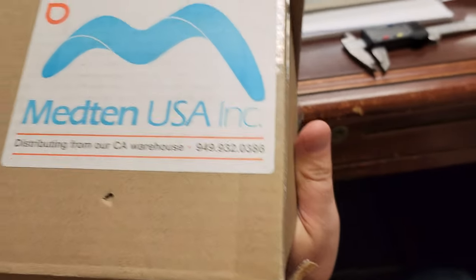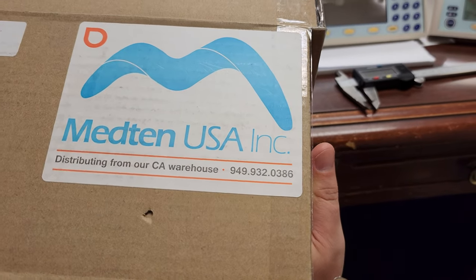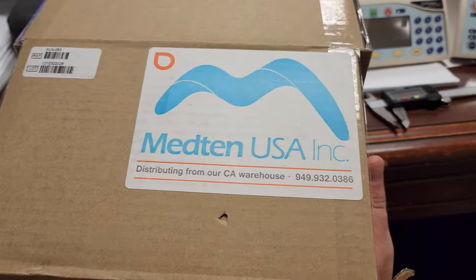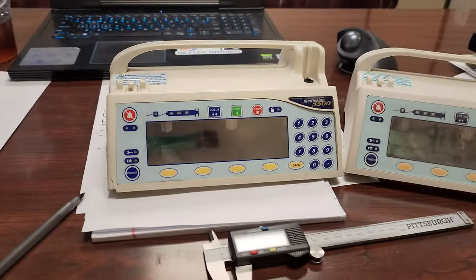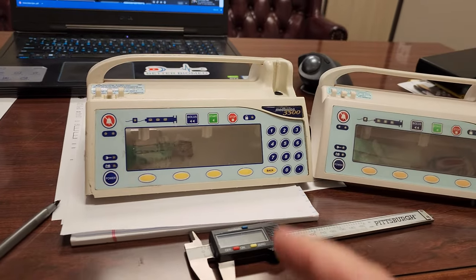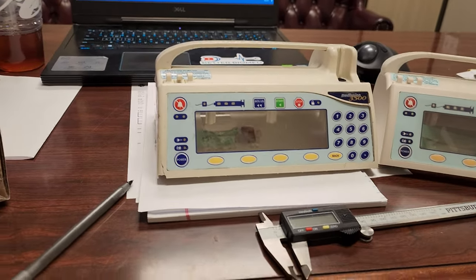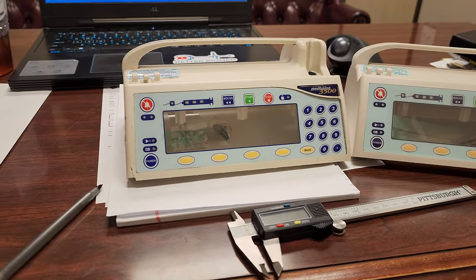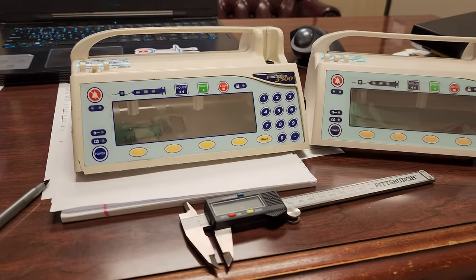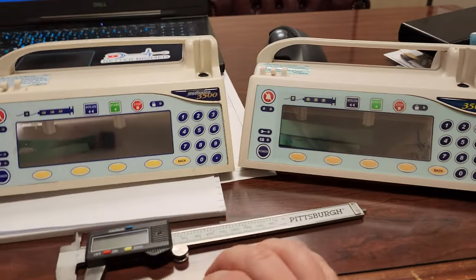This was sent to me by the guys over at Med10 USA — they're based out in California. I did a video on the orange dot cables, which are sold by Med10, and they reached out asking if I'd be interested in seeing some of their other products. I said absolutely, let's do this.